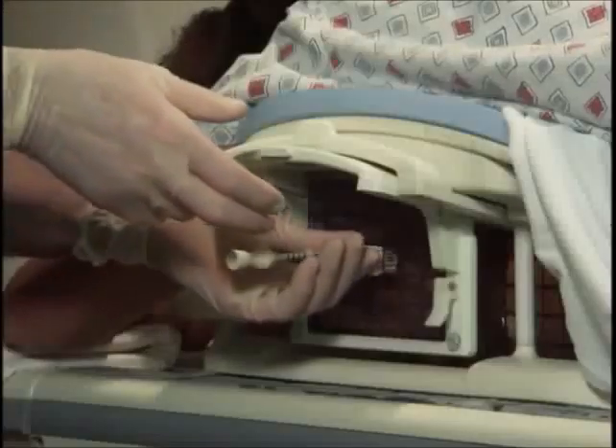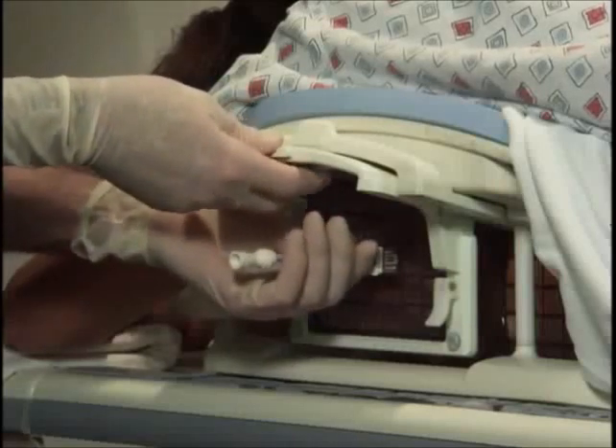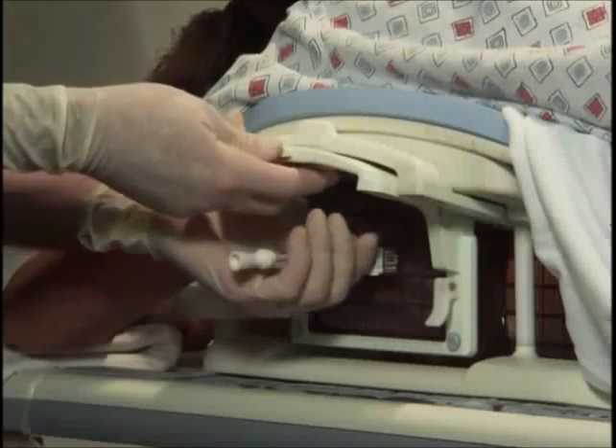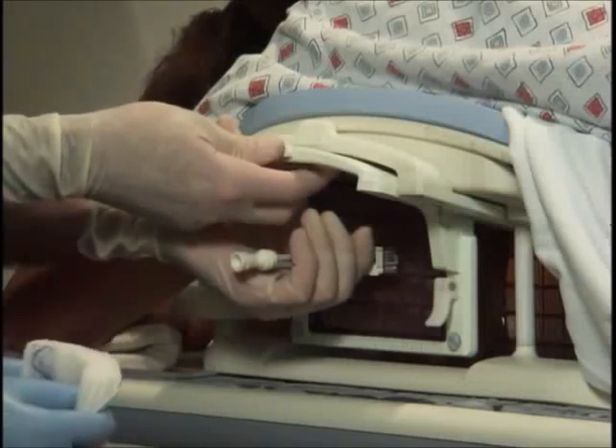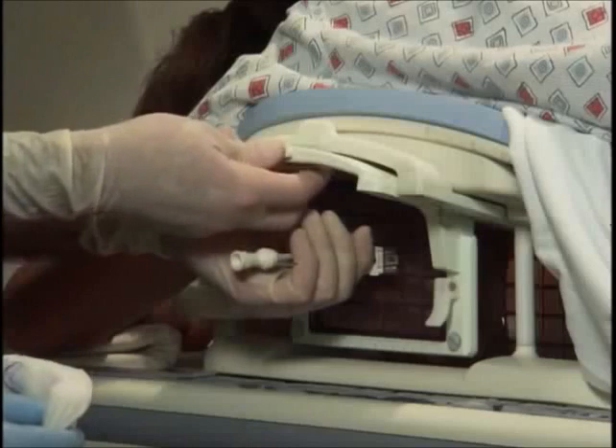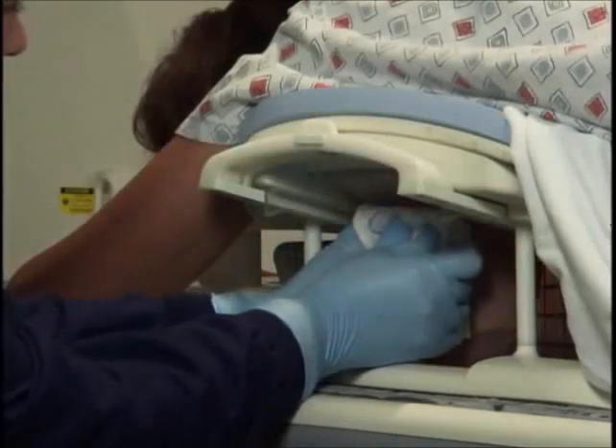Once you're satisfied with your biopsy and have deployed localization clips, you'll remove the sheath simultaneously with the lateral grid in order to get pressure onto the puncture site as quickly as possible. Grasp both of them simultaneously, remove them, and apply pressure immediately to the site.